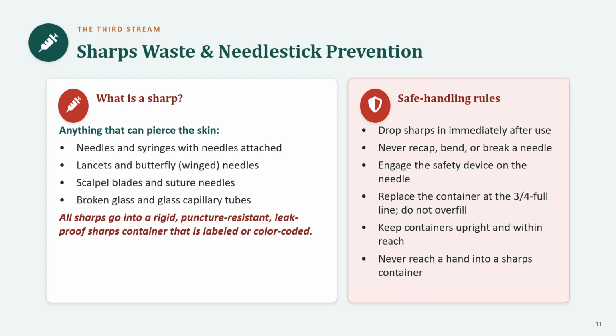color-coded, usually red. Now the safe handling rules, because how you handle a sharps matters as much as where it ends up. Drop the sharp into the container immediately after use while it is still in your hand so it never sits on a counter. Never recap a used needle and never bend or break it because that is exactly when most needle sticks happen.